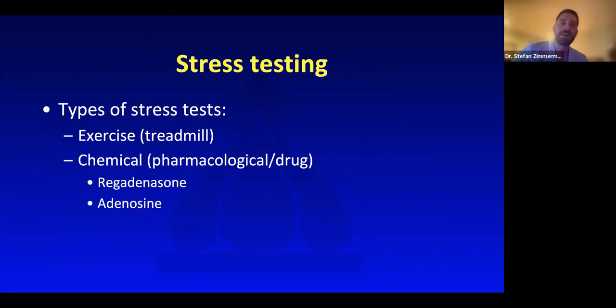Okay, so I want to talk just as an aside about stress testing, because people often get stress tests ordered, and there are a couple different ways they can be done. And they're all good ways to test the heart. Whether the decision to do one test versus the other depends a lot on the patient, on what they're capable of doing, more so than one being maybe better than the other.